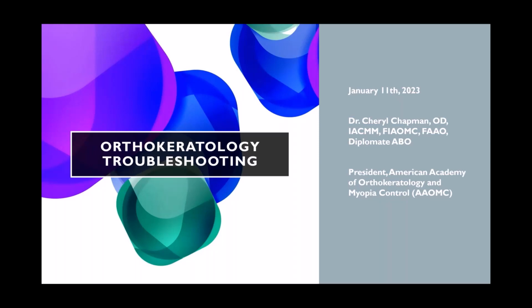Thank you so much. I'm very, very pleased to be here tonight because orthokeratology and myopia management in general is probably one of my greatest passions. I know that this is a highly anticipated subject matter for a lot of doctors who are looking to get started, and sometimes Ortho-K can seem a little bit intimidating.